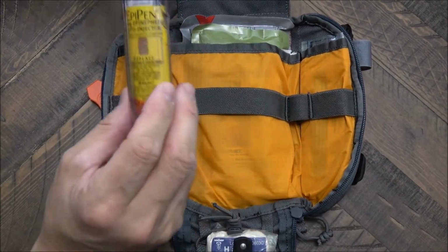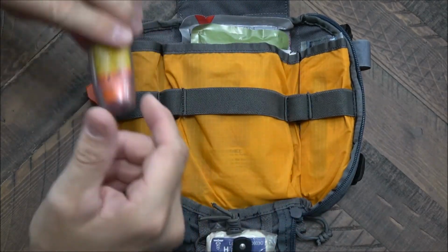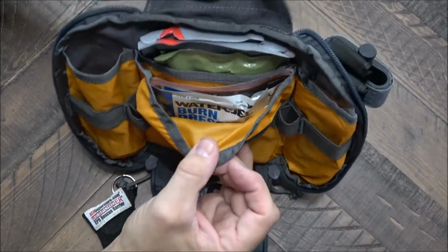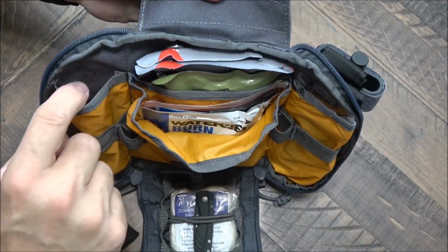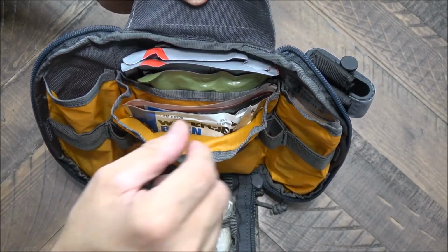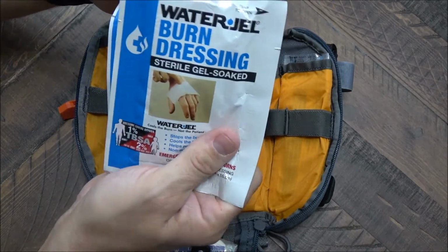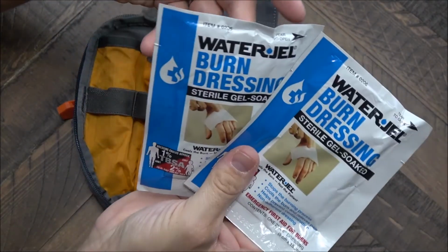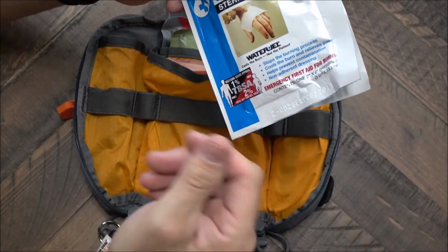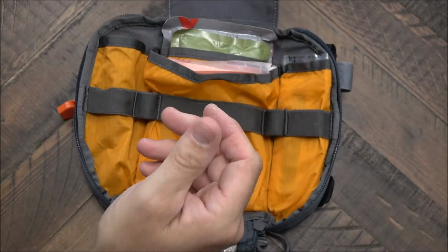Starting on the back, I've got an EpiPen. I've got a bee allergy, so that's the reason why I get these. And back behind this one, so you can see how this kind of opens up, there's several different sleeves here that you can add additional things. I keep several packets of this burn dressing water gel, which is really great for any type of burns, which are sometimes common with camping, those types of things, sometimes even car accidents. So I keep those with me.